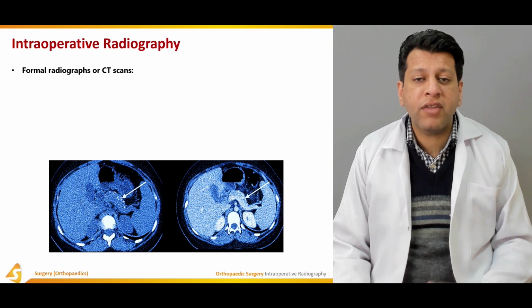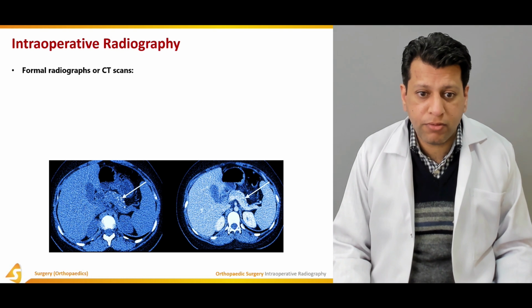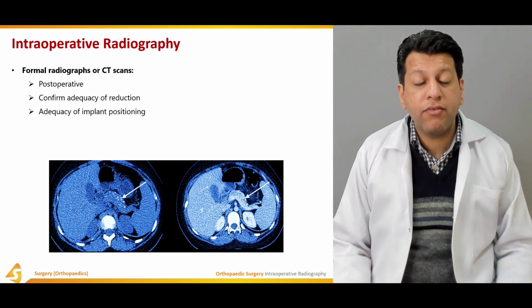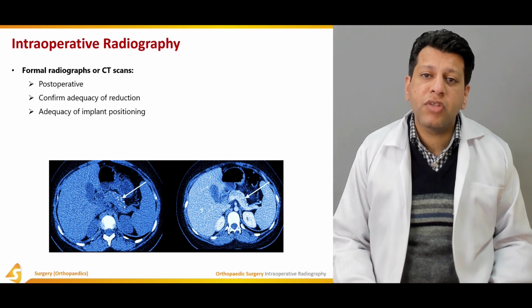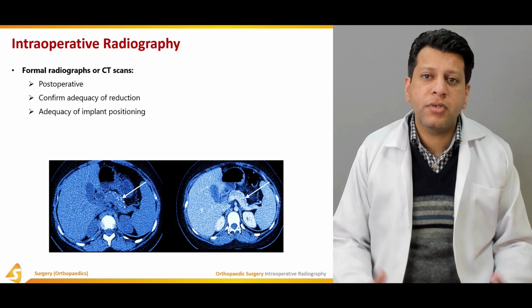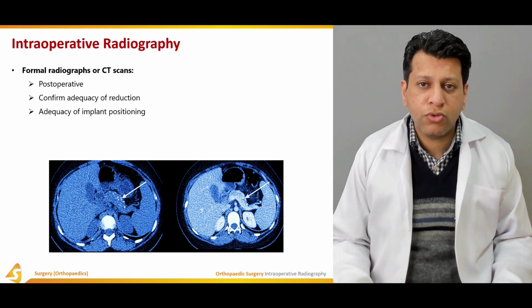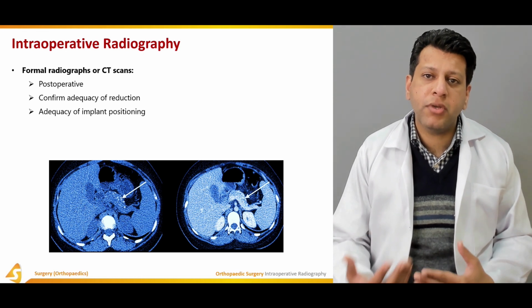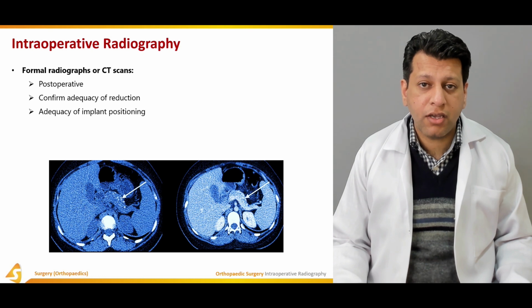Although post-operative and pre-operative CT scanogram is readily available almost all over the world, sometimes X-rays are adequate. Sometimes we may need, for example, a CT scan. For example, if a surgeon has done surgery for DDH and closed reduction was done, post-operatively the patient is in a spica, that is, the child would be in a hip spica.